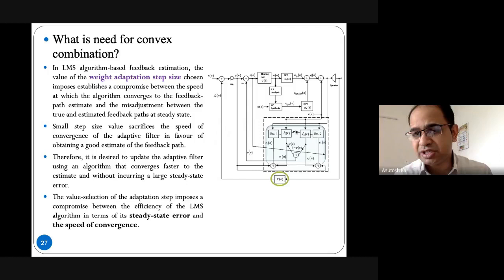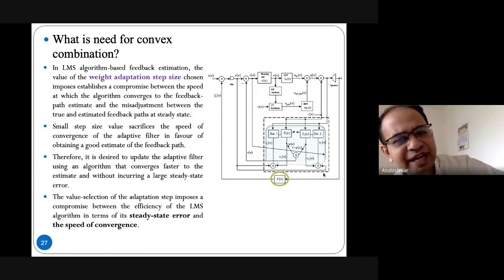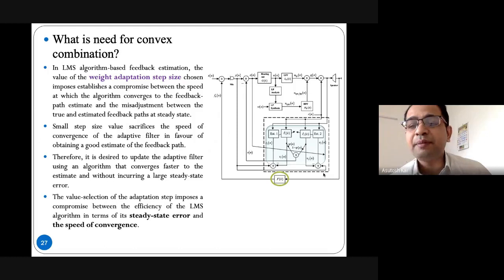The logic is, with a psi n factor that is highlighted in blue color, you can see, this is the contribution part over the BLPC, vocoder based LPC. What we did, we went for a couple of adaptive filters. All other things are intact. The BLPC is intact. The probe noise is intact. We went for the adaptive filter rather than one, two. And in both filters, the weight adaptation step size, in one particular filter it is higher, in one particular filter it is slower. But then it should be intelligently decided.